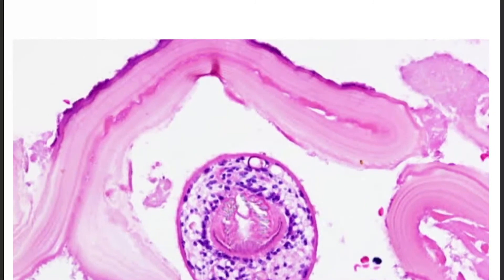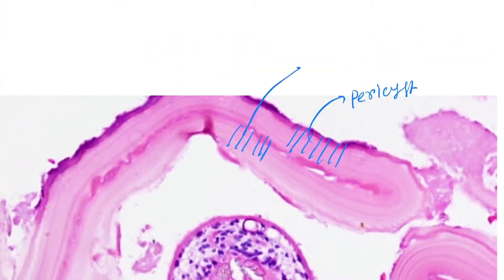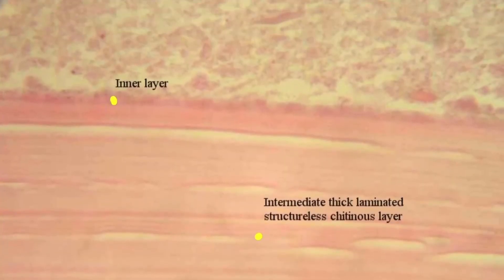Now let's see the histopathological slide. Here it is. This is the pericyst, and this is the intermediate layer. This layer here is called the endocyst.